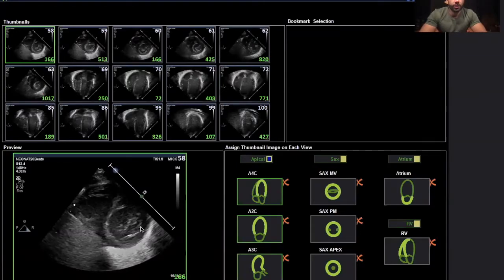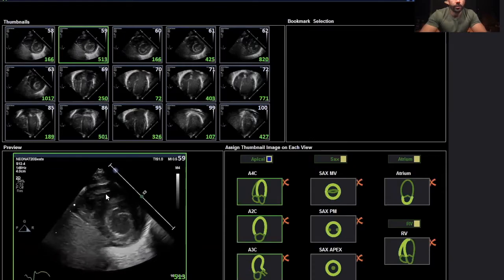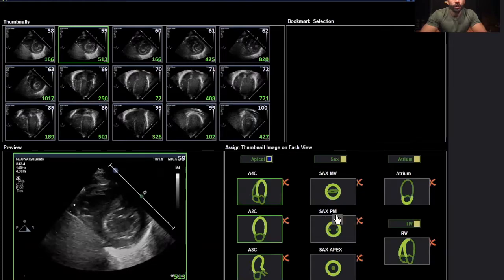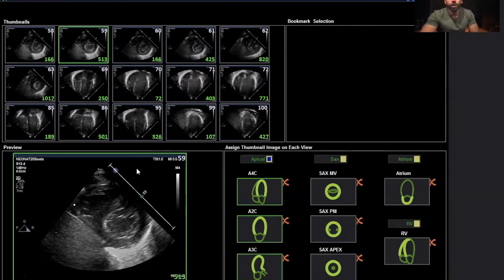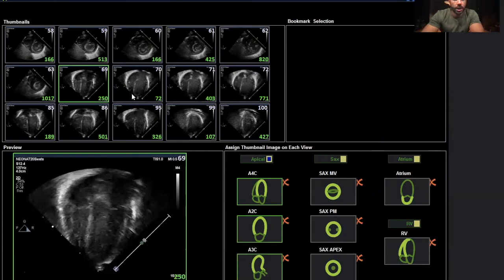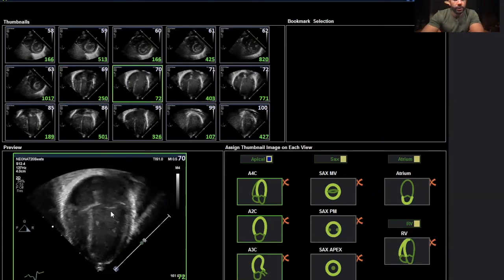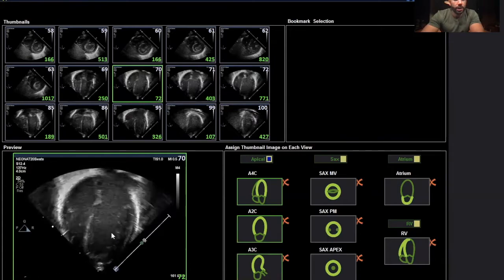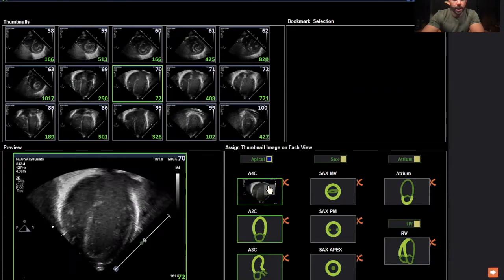We are now on the cardiac performance analysis package. You have the apical views, the short axis views, and the right ventricle panel. Note that this is the adult imaging convention, while we are using a pediatric convention with the apical four-chamber view inverted. We can start by finding the best view of our LV — clicking on the image — and I can see the left ventricle clearly, so I will use this one for the apical four-chamber view.